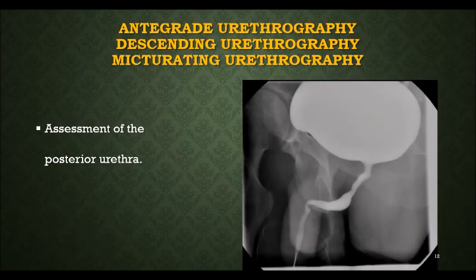The antegrade urethrography, or descending urethrography, or micturating urethrography, is done when the bladder is at maximum fullness.